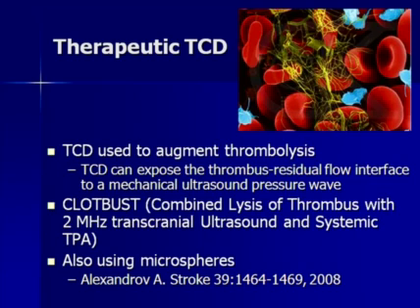Now, the very interesting aspect of transcranial that we'll finish up with here is the application of transcranial Doppler in a therapeutic modality. There have been several papers. Dr. Andrei Alexandrov has published extensively on this, and there are some clinical trials. Basically, what happens is they use the intensity from a transcranial signal to help get thrombolytic agents through a clot. Here's just a diagram of a clot.